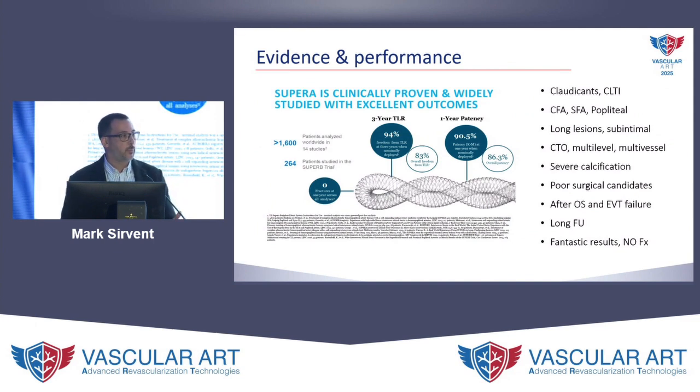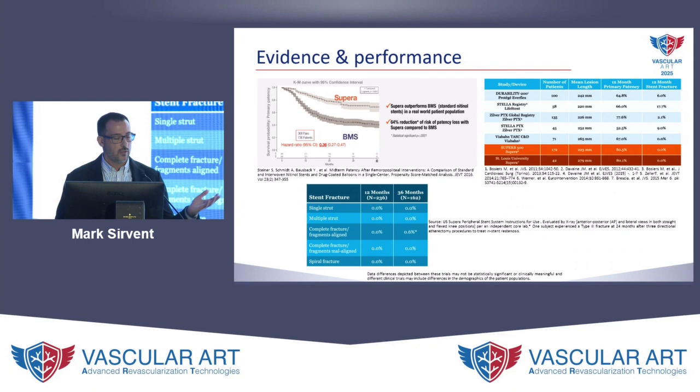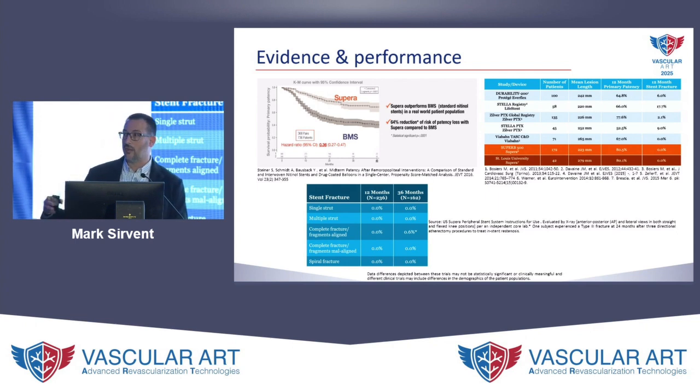It has very good performance in all the scenarios, in all the territories in the FemPop segment: in claudicants, in critical limb ischemia, in the common femoral artery, in CTOs, in subintimal approaches, etc. In comparison with bare metal stents or drug eluting stents, the fractures described in the literature are anecdotal.